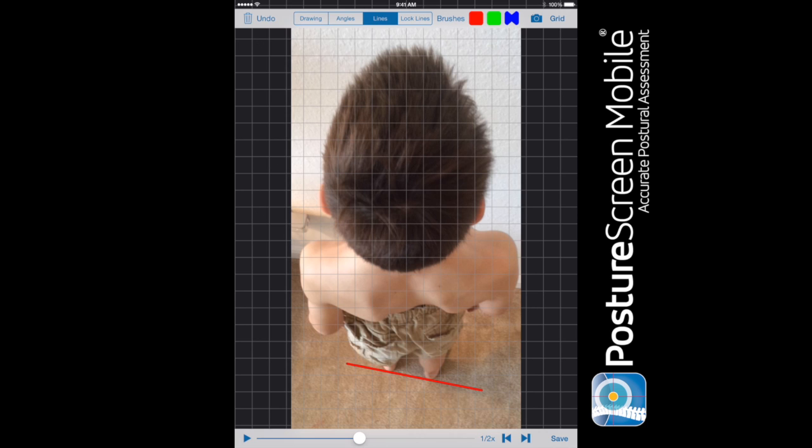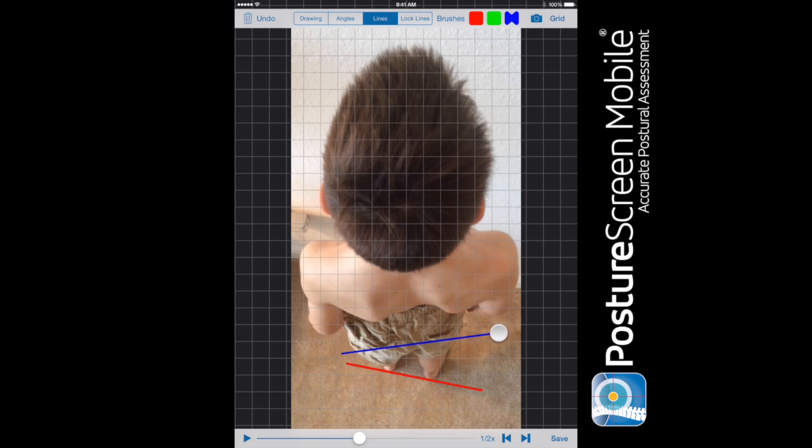And with this, if he was wearing tighter shorts we could probably see the posterior glutes, but what we're going to do on this one is I'm just going to use points. I'm going to try and do the best bisection of the hips that I can, so I'm going to go ahead and just go right through here, kind of using the pockets as an idea.